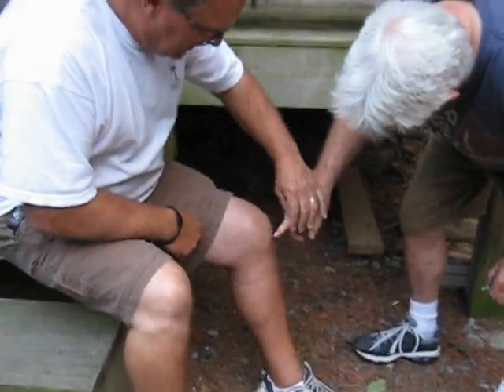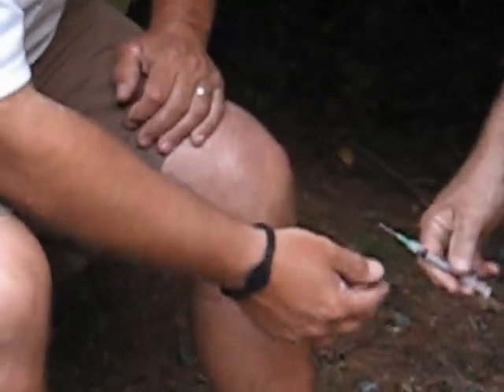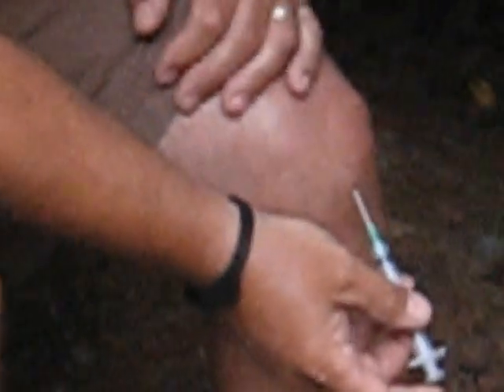Put the thing all the way in, right in there. Like this, right here. Don't push any air in it. This ain't a vein, this is a drainage. I don't know if it's going to drain, but let me just touch it in.